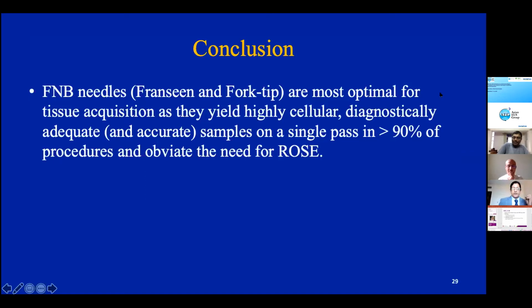Shyam, as always, a very excellent and lucid talk. Regarding the slow pull technique, what's your take on it? We always used to be very skeptical about the technique. That's why we thought we should prove it in a randomized trial.